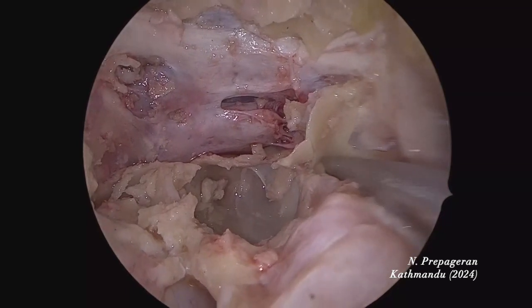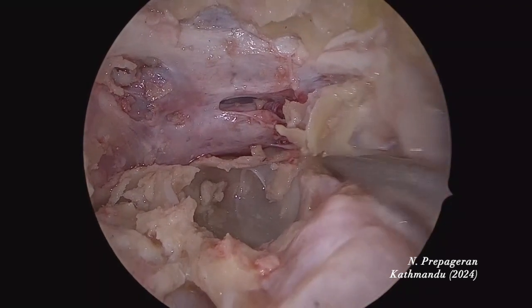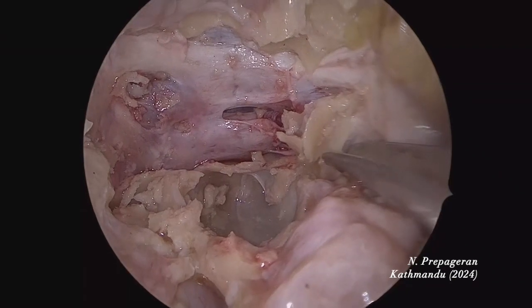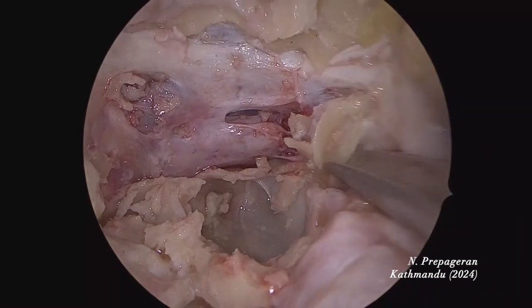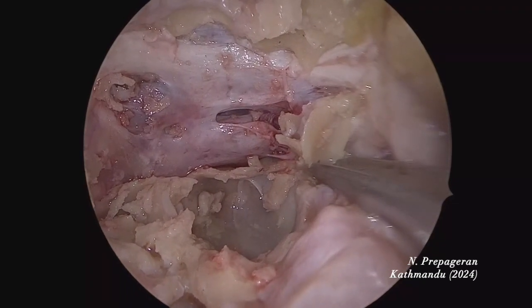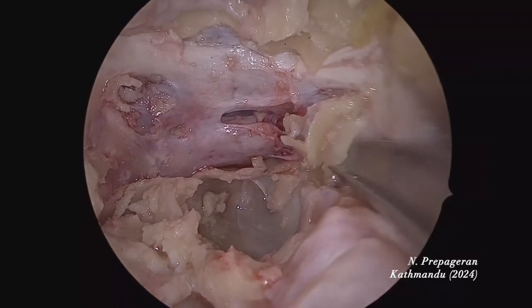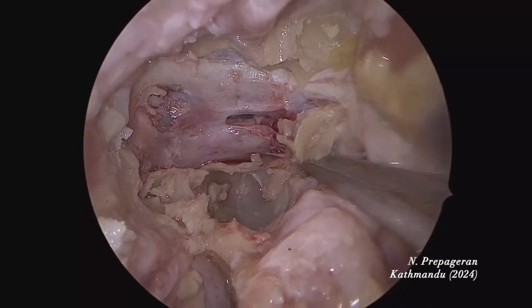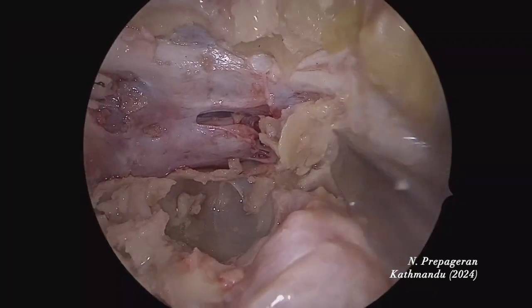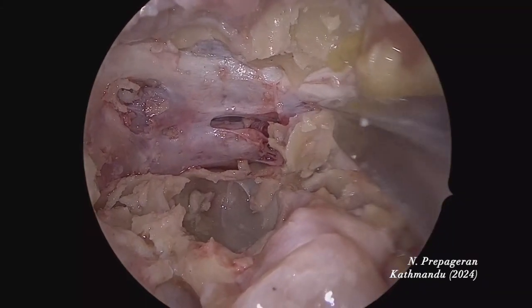I only use the drill to expose a bit of the dura. What size chisel is this? Whatever the girls gave me — this is our second plastic chisel and it works quite well. Like I said, you just have to make do with whatever you have. The chisel is a bit short — that's the only problem.